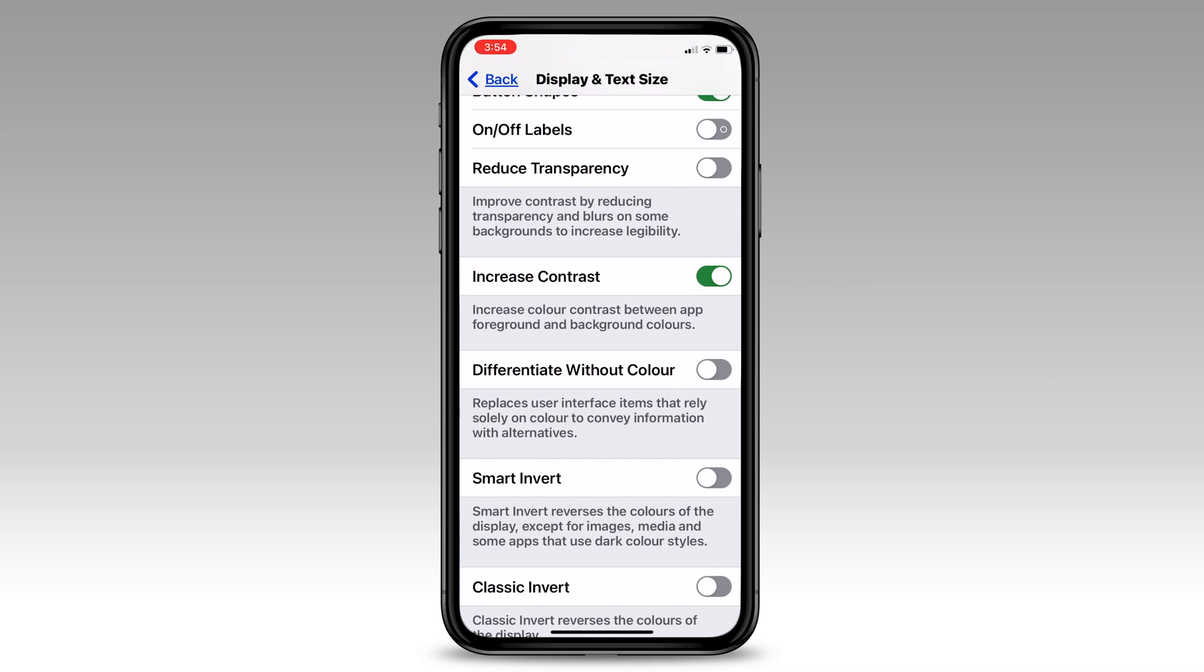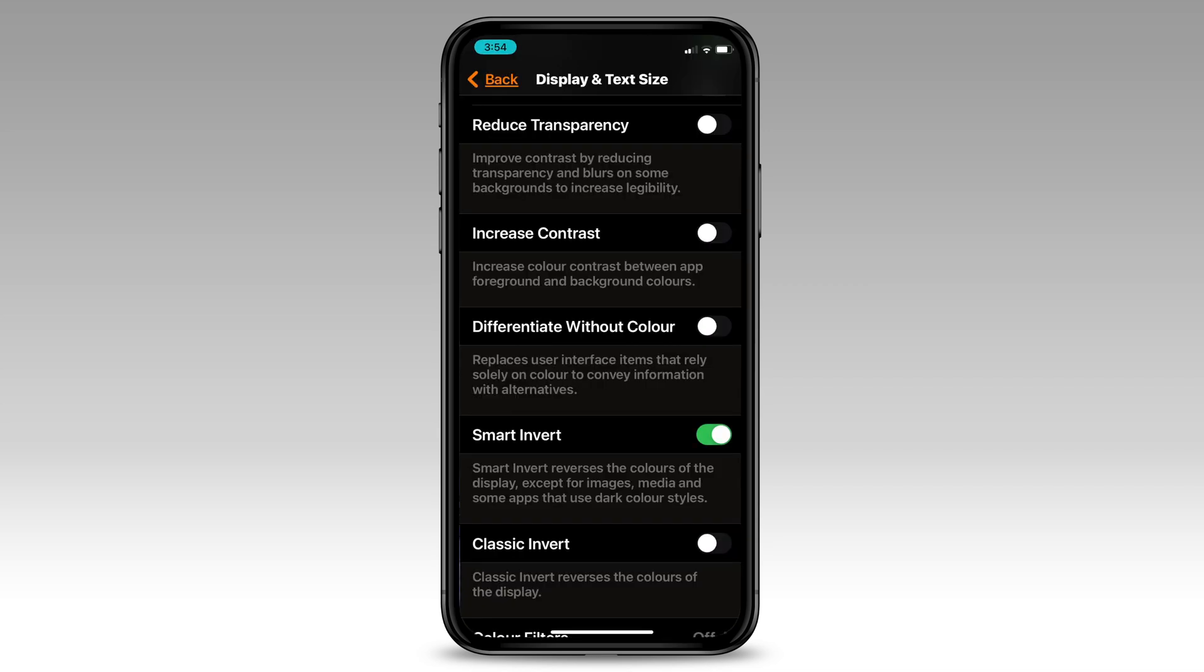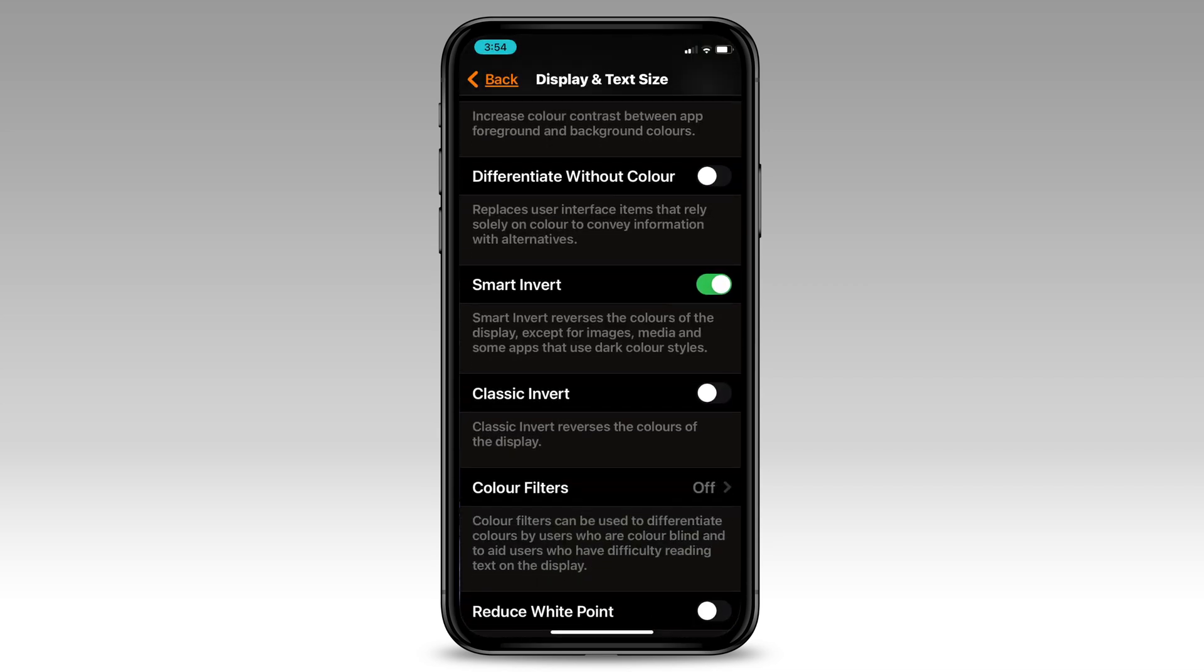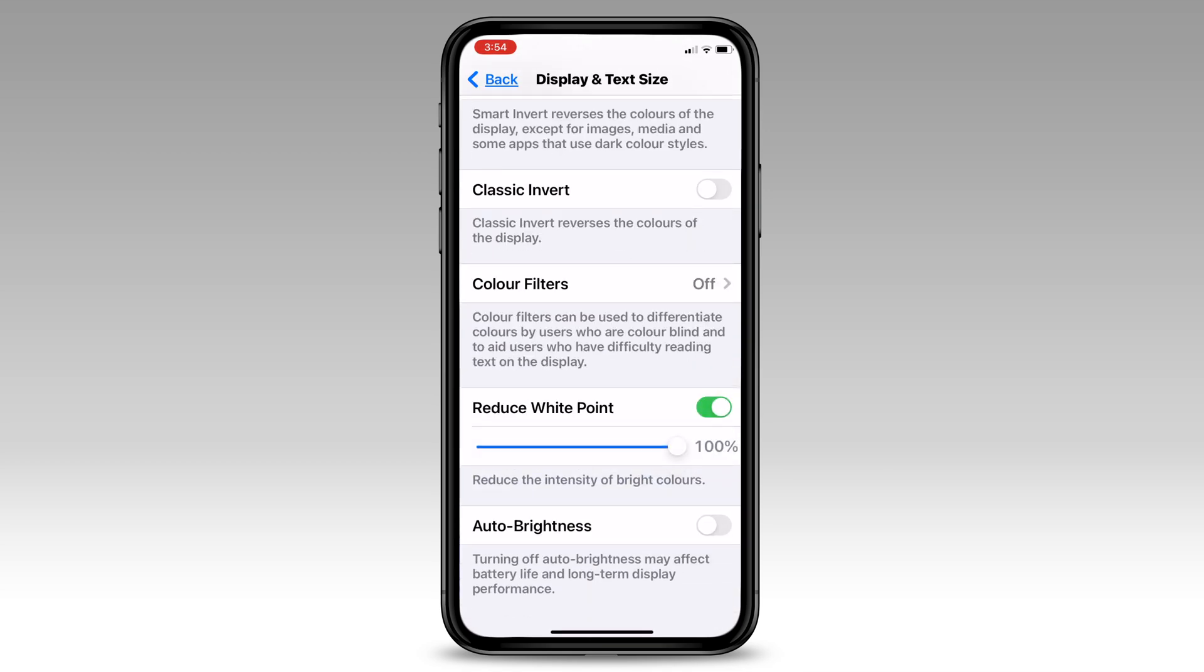We can also adjust how our screen displays. We can increase the contrast to make buttons stand out and make everything on the screen easier to see.